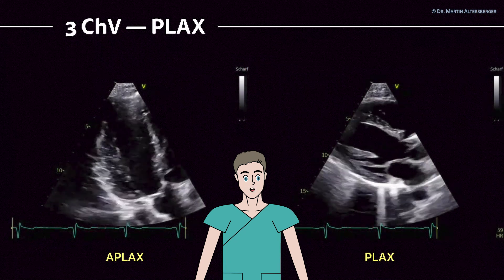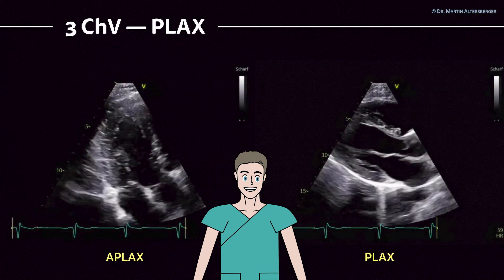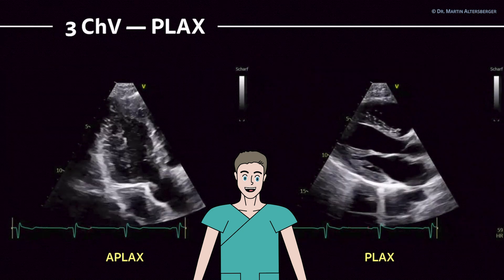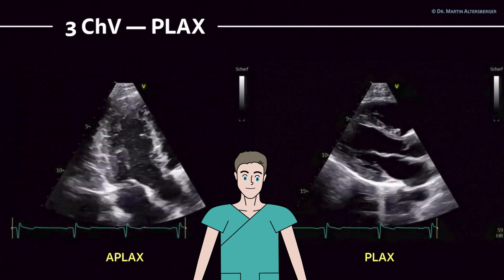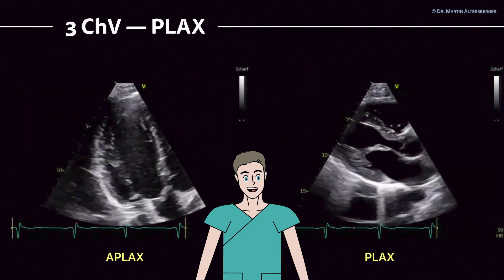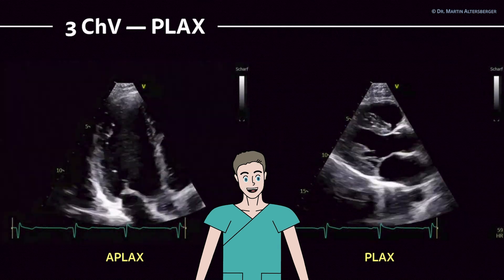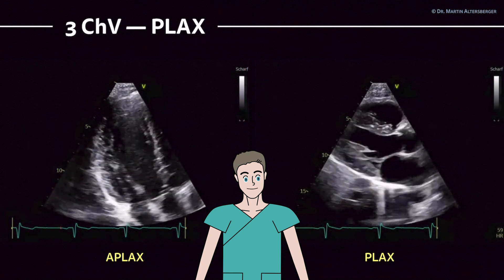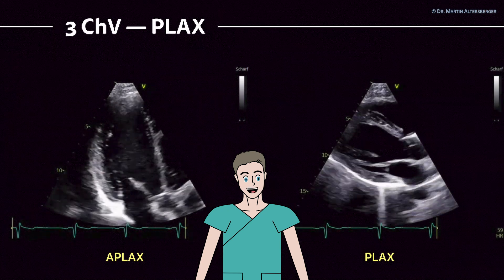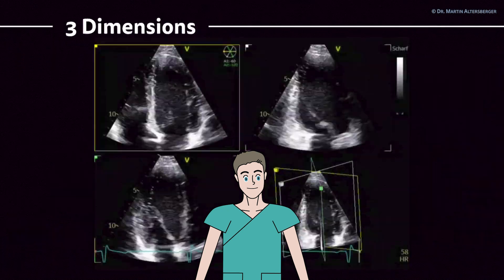In the parasternal long axis view, you do not want to see the apex of the left ventricle. In the apical long axis view, it is essential that you also visualize the apex for measurements, wall motion abnormalities, and strain imaging.